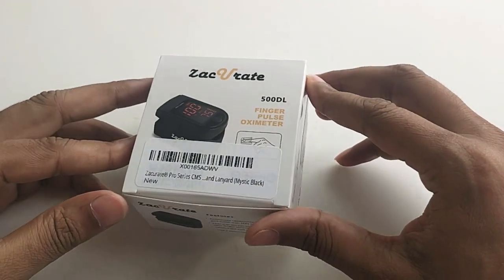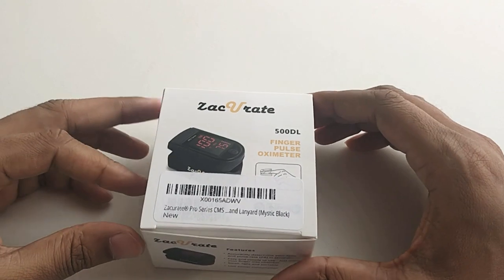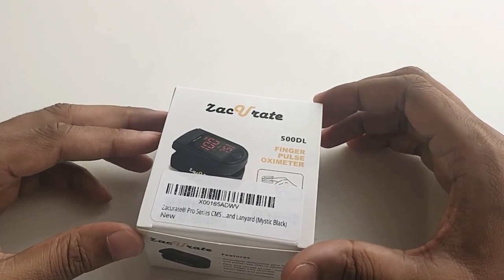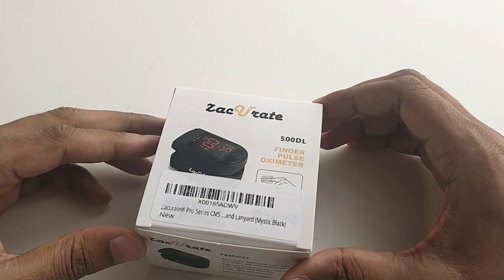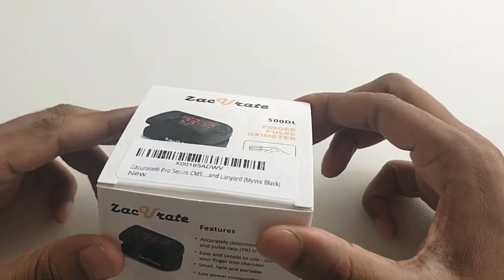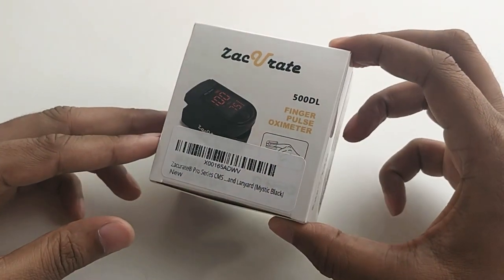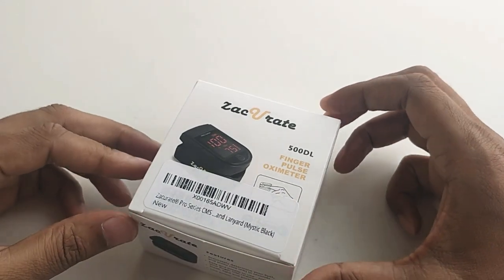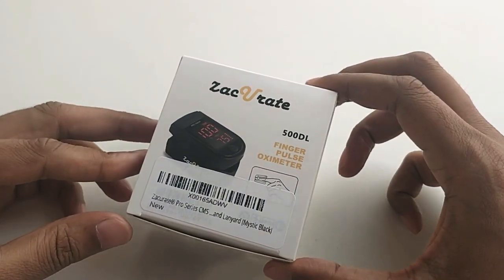If you are suffering from COVID-19, the oxygen level goes down, so in that case you should have this device to check the oxygen level. There are so many brands available to check your oxygen level. I bought Zacurate and I wanted to show you how it works.